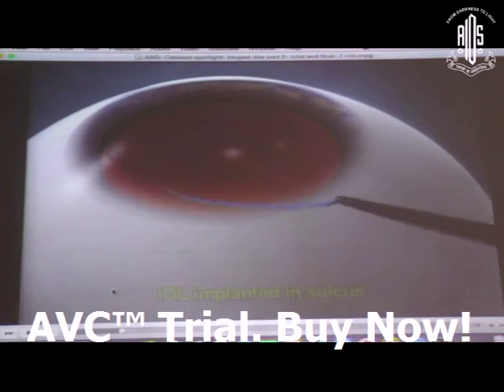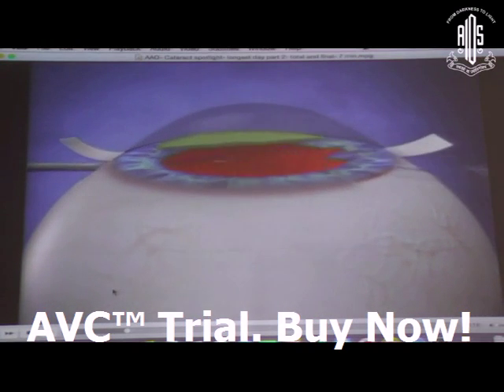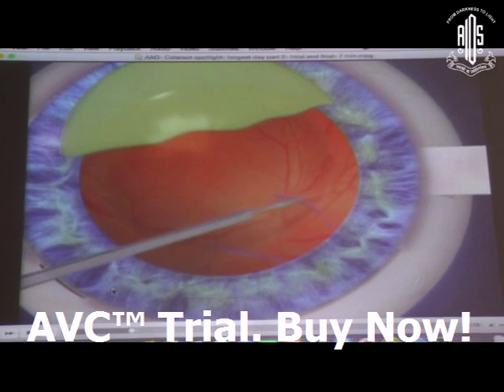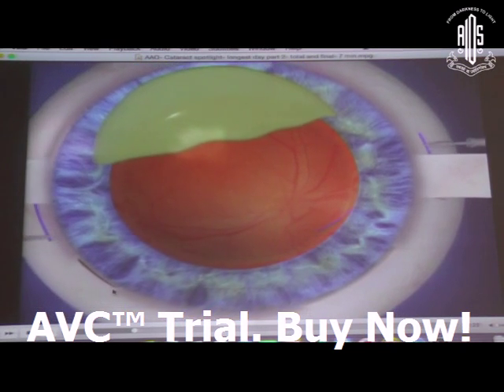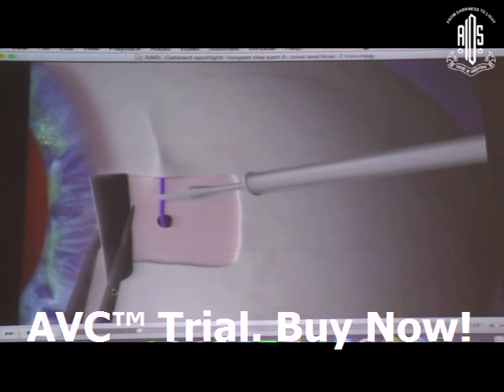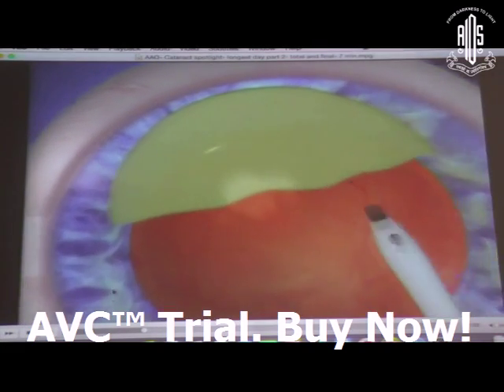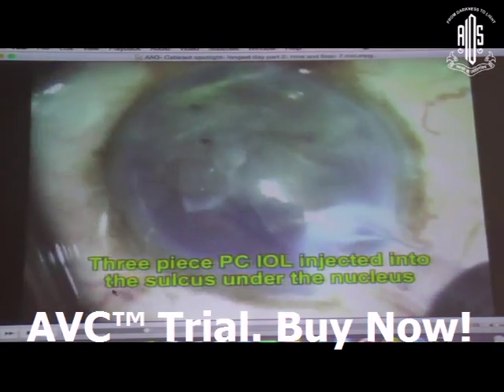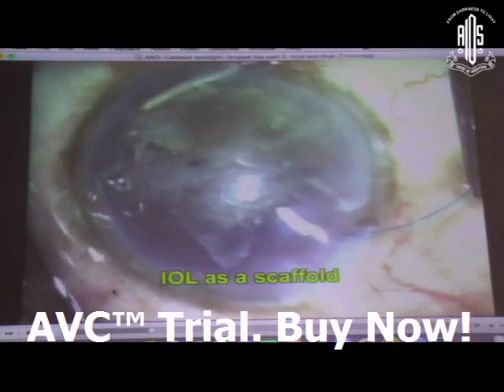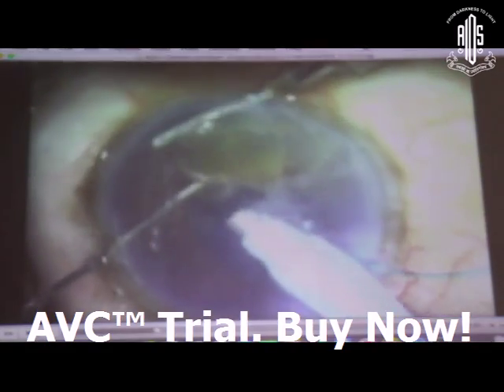So this is one complication, and the first one was presented by Michael Lawless in the JCRS, and in Ophthalmology he has published articles of dropped nucleus after femtocataract. You can also do a technique like I talked many times on, where you first do the glued IOL so that you can remove the fragments much more easily. But in this particular case, which I'm going to show you here, I tried to do a scaffold because I brought the nucleus up anteriorly. Once I put it in, I have it as a support and I could emulsify the fragments.